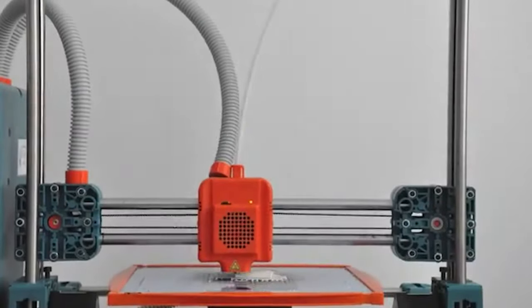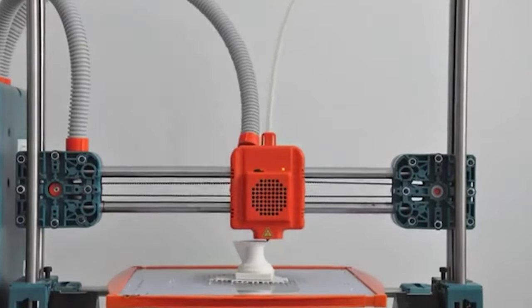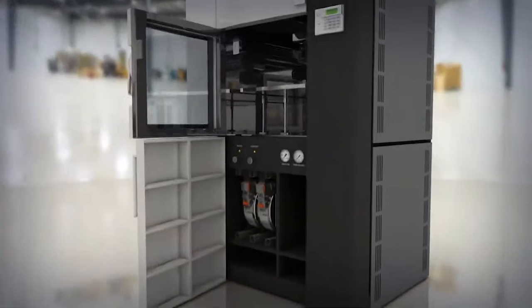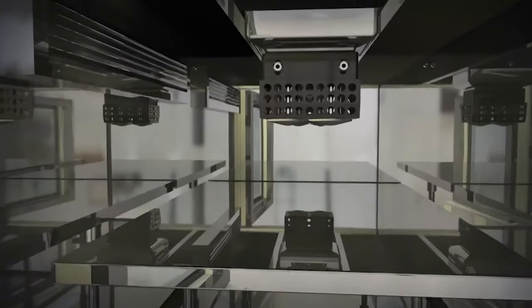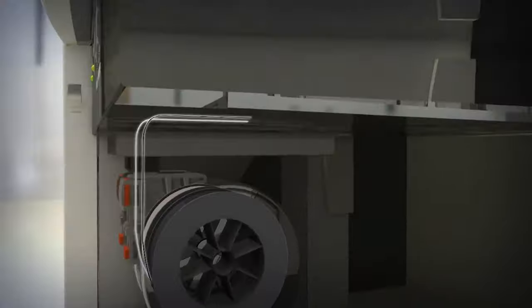In most cases, 3D printed orthopedic casts are made from FDM 3D printers. The cast model is formed through layer by layer application of molten plastic filament. The main advantage of FDM 3D printing technology is the low cost of the material, which means that the models made turn out to be cheap. However, this technology has one major disadvantage, that is, slow printing speed. As a result, medical centers cannot create a 3D printed cast as a patient waits in the lobby.